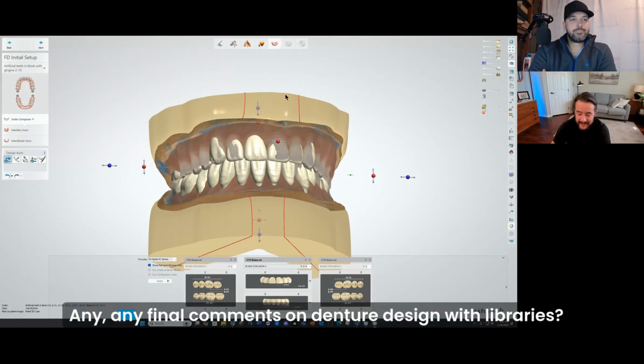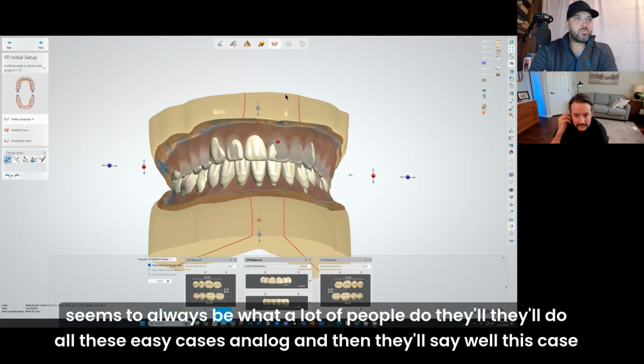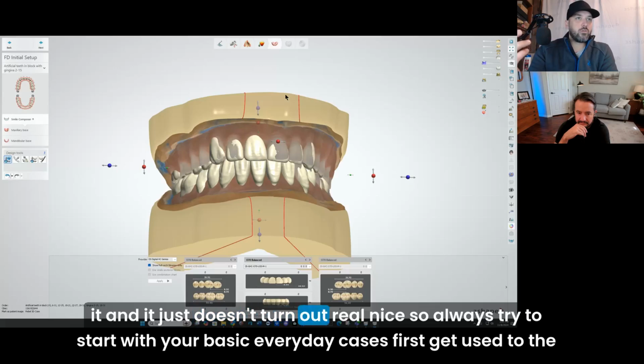Well, thank you, Brandon. Any final comments on denture design with libraries? I guess the best advice I could give someone starting with these is don't start on your most difficult case. That seems to always be what a lot of people do. They'll do all these easy cases analog, and then they'll say, well, this case, I don't know if I could do this analog, so I'm going to try it digital. And then it ends up as a disaster for them because they don't understand the workflow, they don't understand the tools, they fumble with it, and it just doesn't turn out real nice.